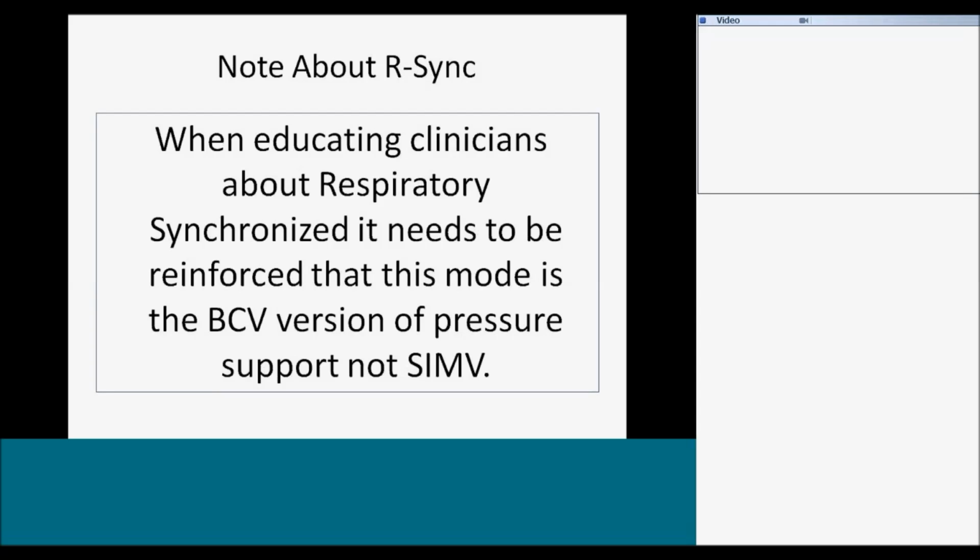There has been confusion, and I've had phone calls. It was interesting from one facility with a doctor who represented one side of the argument, which was the physicians, called me, and then a day later, a respiratory therapist who represented the other side of the argument called me, and they were arguing that respiratory synchronized was like SIMV on positive pressure ventilation. That was the physician side, and then the respiratory therapist would say, no, it's more like pressure support on positive pressure ventilation. Well, it is probably the BCV version of pressure support.